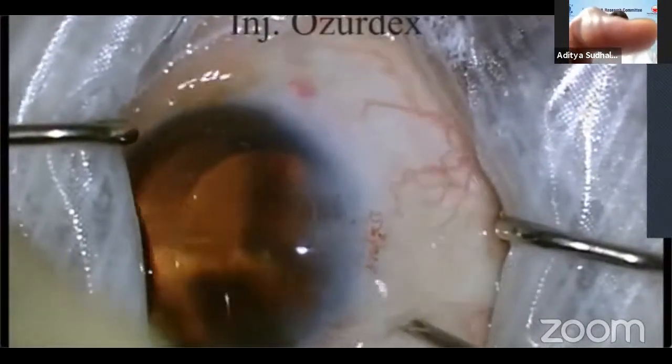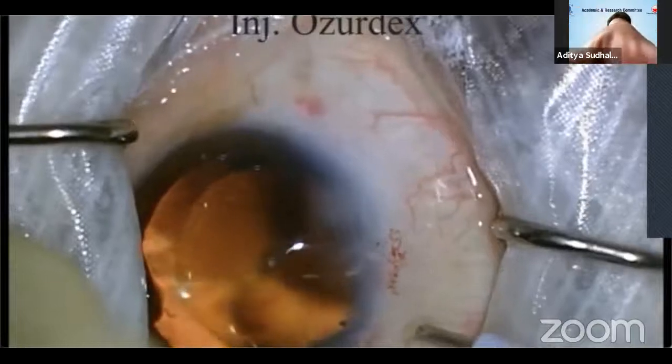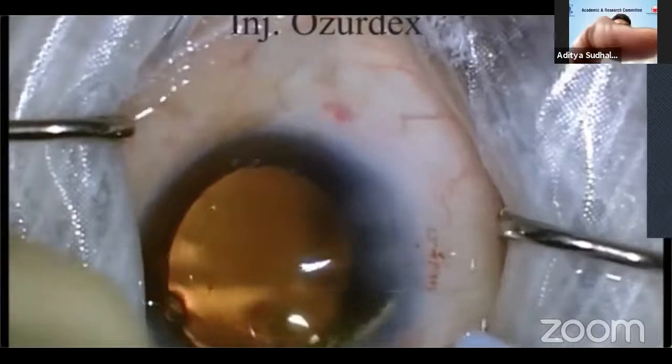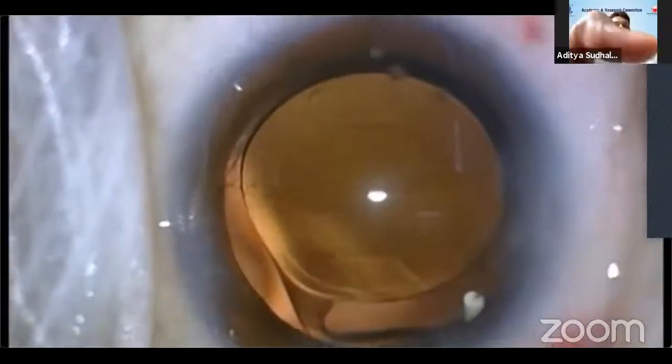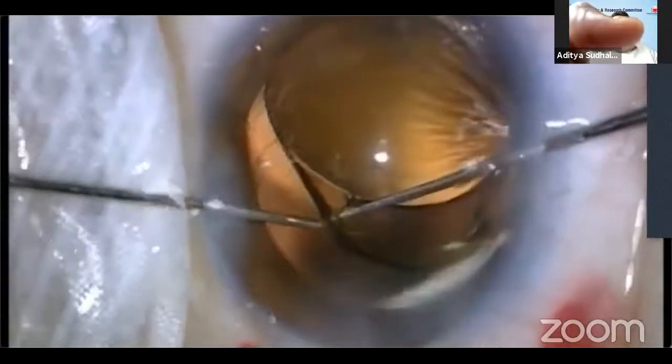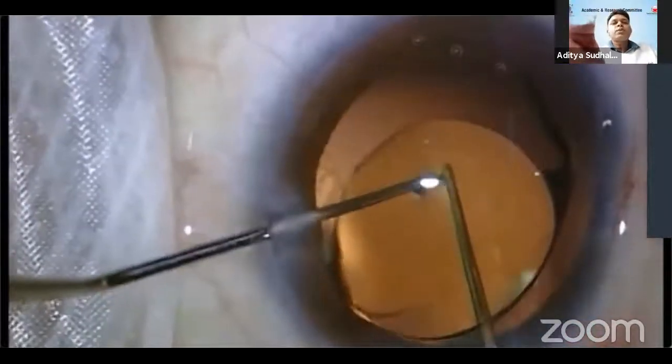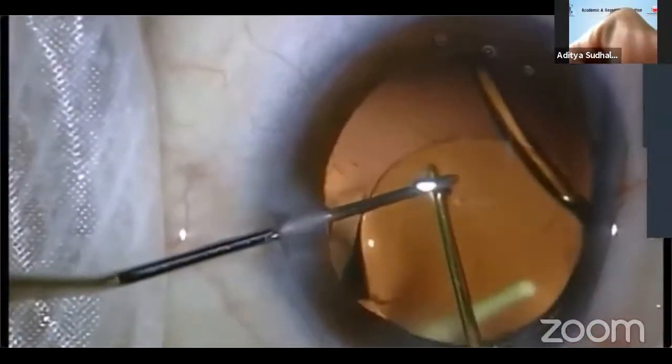So here you can see that the surgeon is going in much like he would with a phaco probe with the bevel up, and you can see the IOL getting displaced by the needle, and the intravitreal implant has been inadvertently injected in the bag itself. So this has caused a posterior capsular rupture, and what was then planned in this case was a reverse optic capture to ensure that the haptics don't cause IOP rise, and at the same time we can assure the patient of a well-centered, stable intraocular lens without having to remove the single piece.